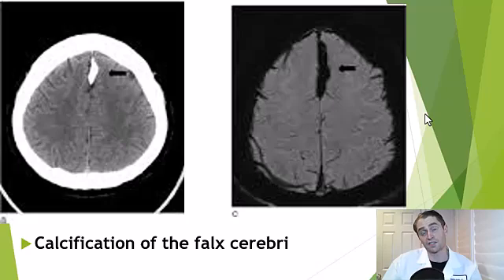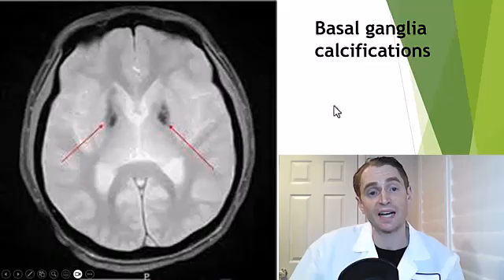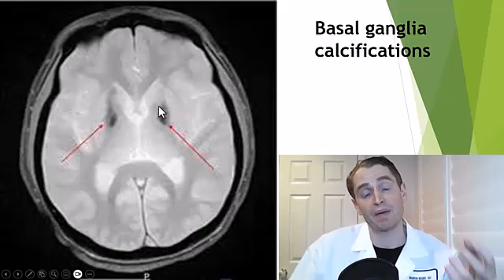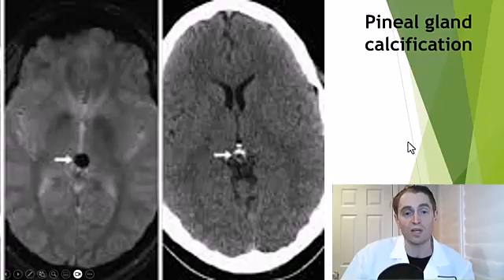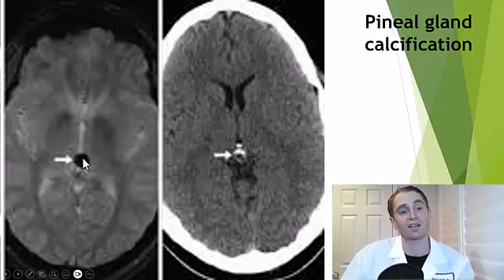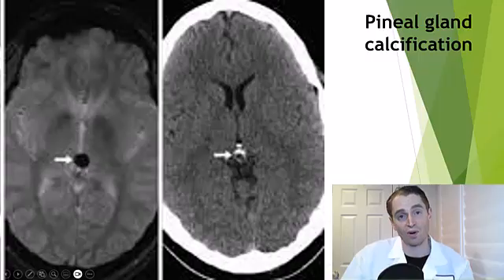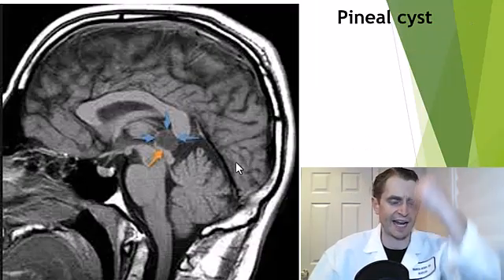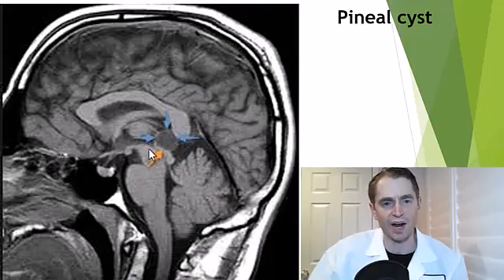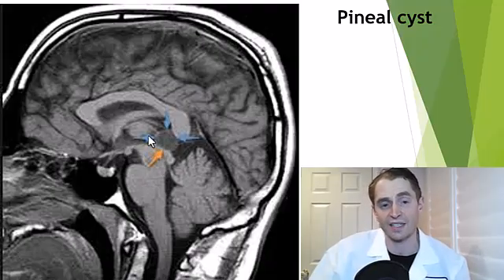Sometimes the calcification can be quite impressive, as in this image. It's also common to have calcification in the area of the basal ganglia — that's often very symmetrical — and in the pineal gland. You can also have cysts of the pineal gland. You're looking at sagittal images; here is the midbrain, and immediately above that is the pineal gland cyst.